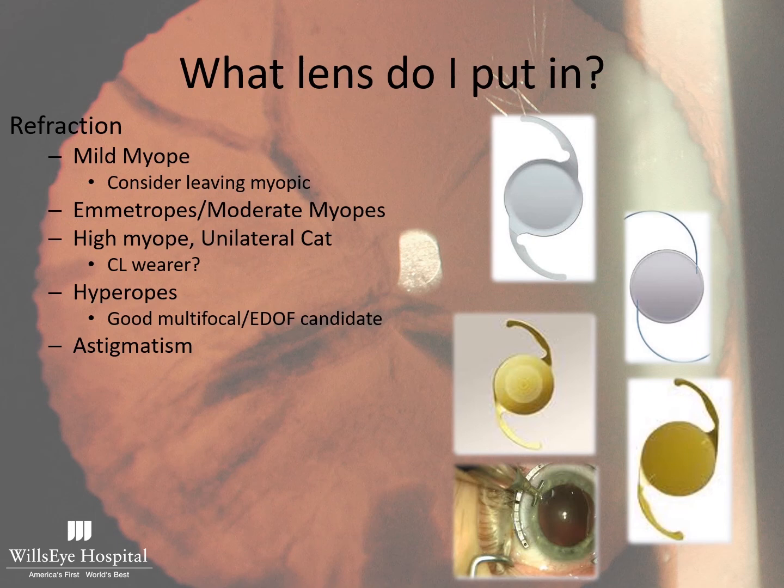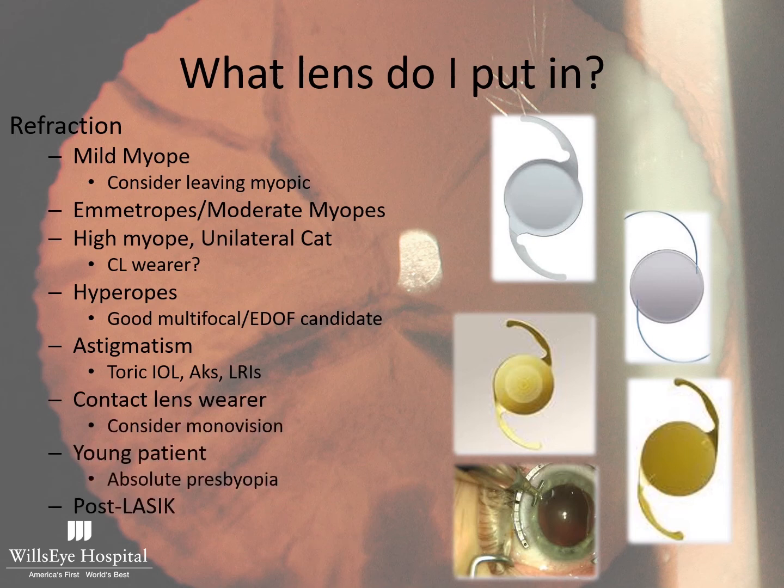Patient has astigmatism, you obviously want to consider correcting that. You can use a toric lens, femtosecond laser assisted arcuate keratotomies, or limbal relaxing incisions. Contact lens wearers, again, consider monovision.